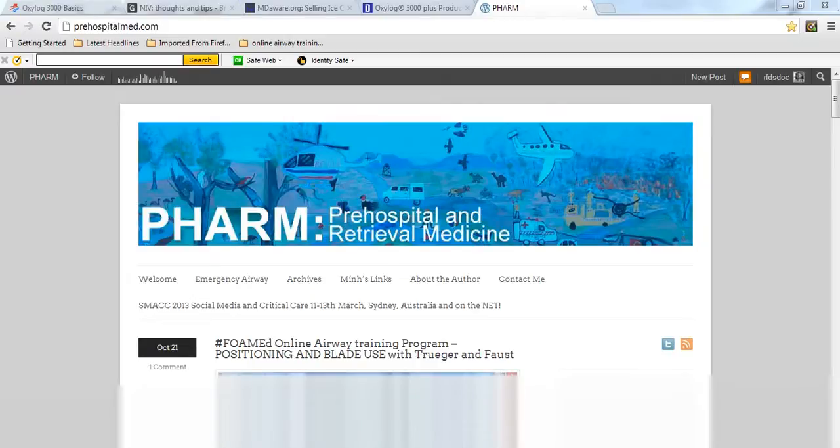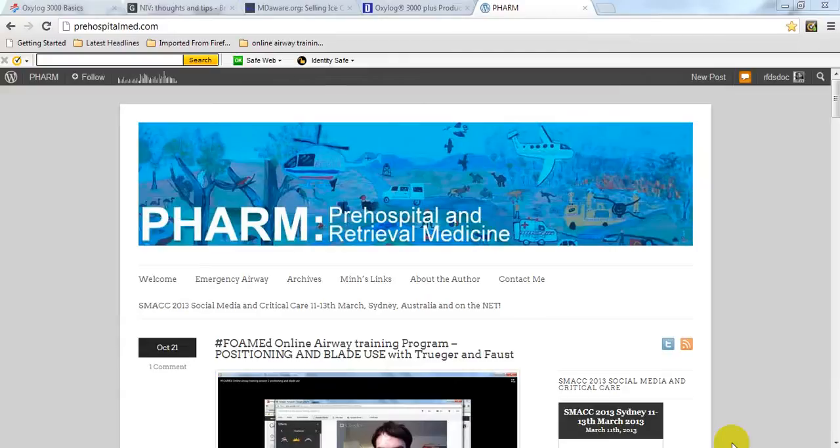Hey folks, it's Min Lekong of the PHARM blog, Pre-Hospital Retrieval Medicine. Welcome back to PHARM. I saw a tweet from Dr. Andy Neal who runs the Emergency Medicine Ireland blog, and he was asking whether anyone had any advice about using the Oxylog 3000 in non-invasive ventilation mode.